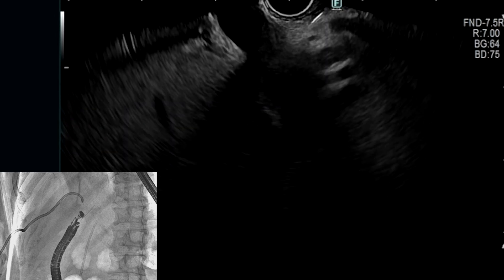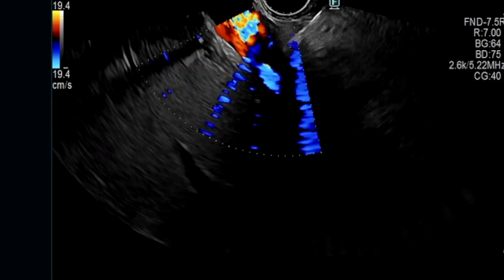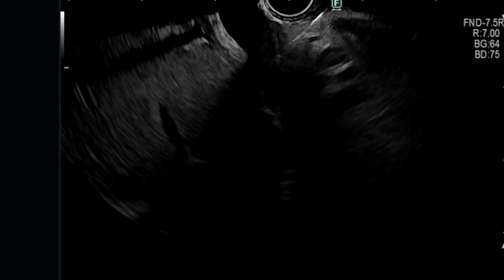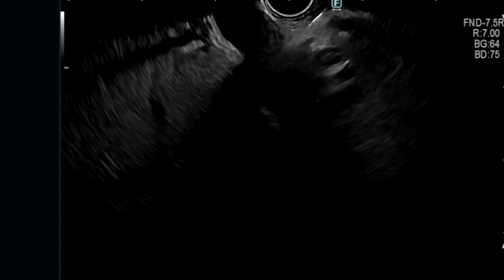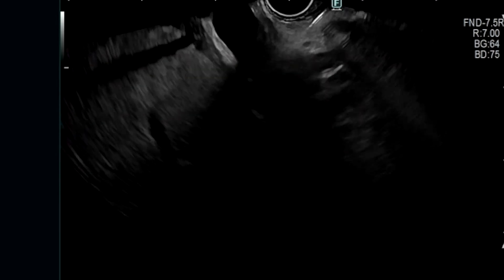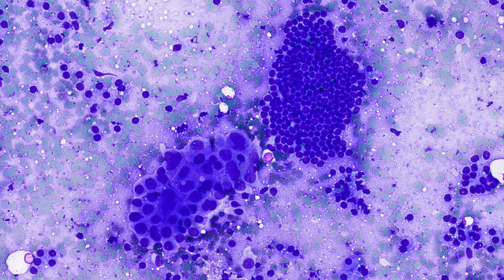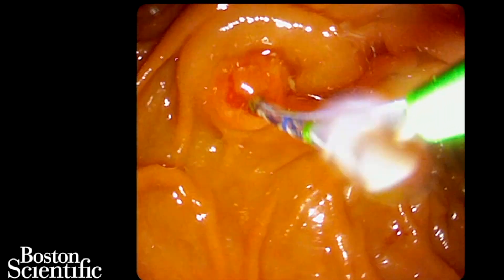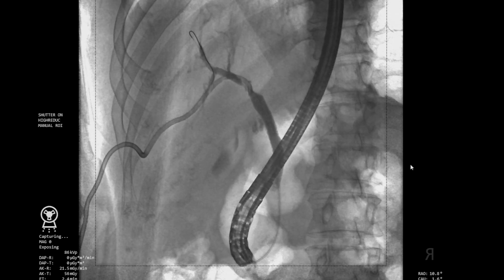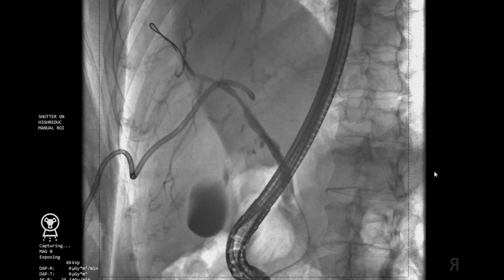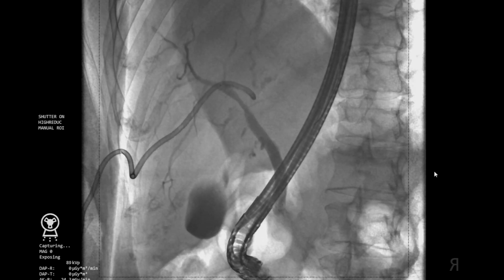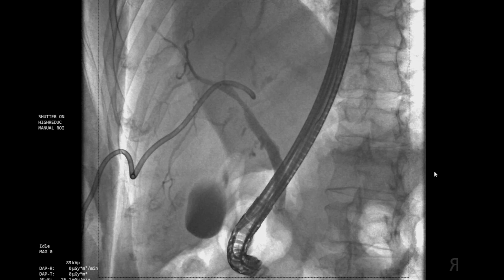Please note that the normal-appearing wall of the portal vein is carefully avoided when tissue sampling is undertaken. Rapid on-site evaluation showed the lesion to be an adenocarcinoma. An ERCP was then performed for biliary decompression. The papilla was first selectively cannulated, then the guide wire was passed across the common hepatic duct and into the right main hepatic system, followed by placement of a 6mm by 8cm EPIC self-expanding metal stent for biliary decompression.